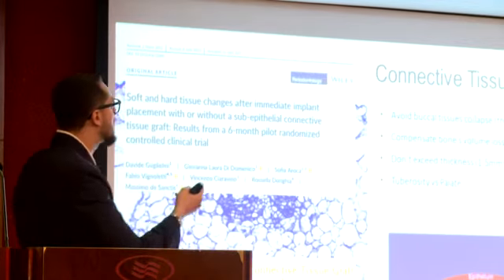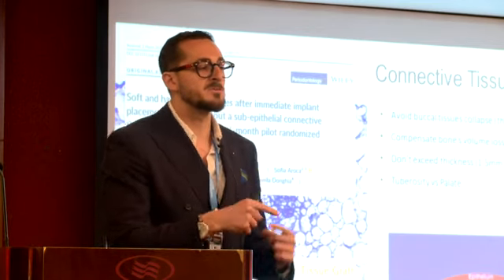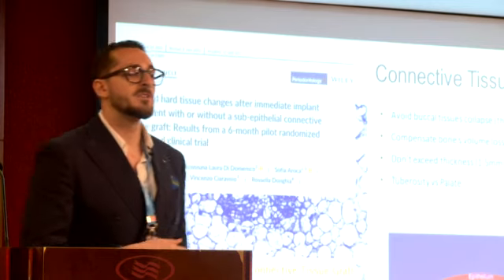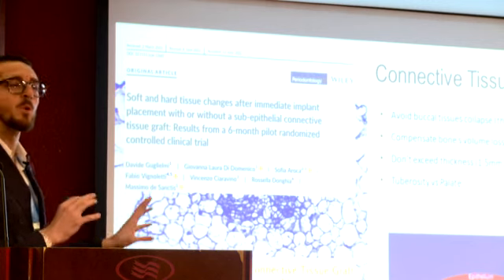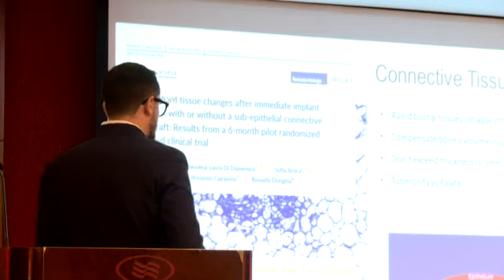It's a soft tissue graft, and I also don't use a synthetic tissue graft. I don't like the use of synthetics because over time they are not as stable as the proper natural tissue of the palate or the tuberosity. In this case, I'm just doing a soft tissue graft with no bone. Okay, we are going to see the bone graft too.